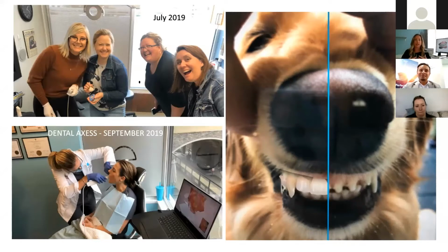the necessity of changing their dentures, or sort of giving them a real version of what I have in my head. There's lots of times when I'm discussing with a patient, well, your center line's off, the teeth are too long, they're too short, your plane of occlusion is off. This gave me the ability to show them on their face, in their mouth, what I'm thinking.